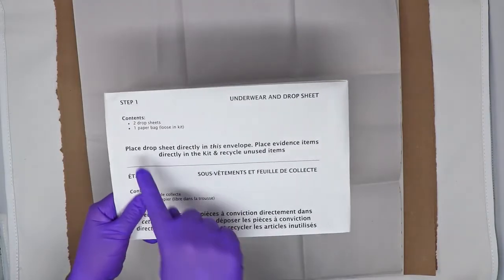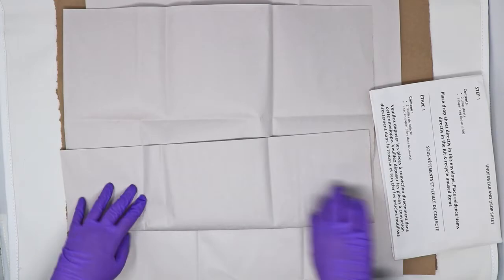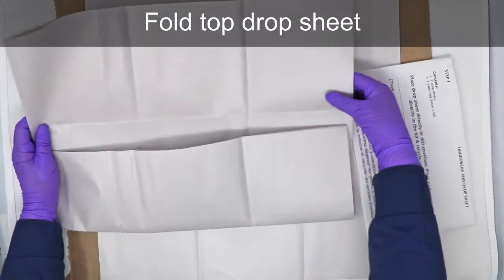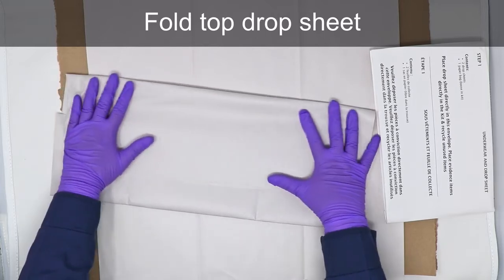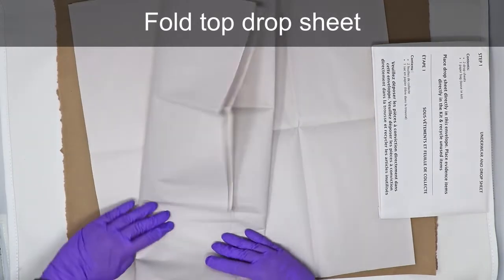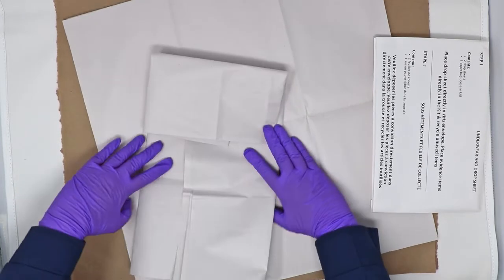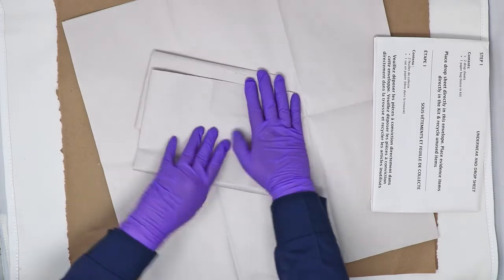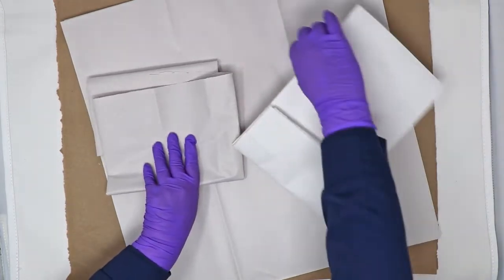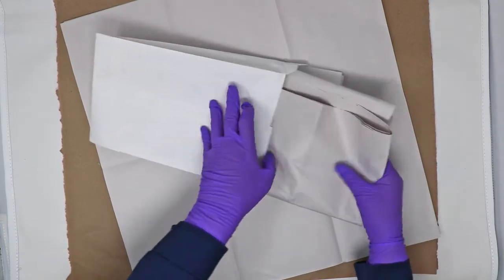The upper drop sheet is then folded to be preserved in the Step 1 envelope. This should be folded in such a manner as to preserve any trace material or debris that is contained within it, and such that the paper would fit inside the envelope provided. Once folding is complete, the upper drop sheet can be placed inside the Step 1 envelope, and the envelope can be sealed using the self-adhesive tab.